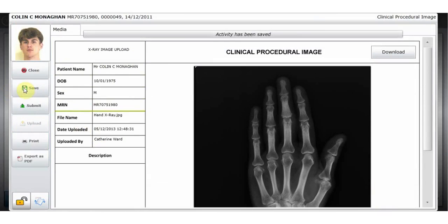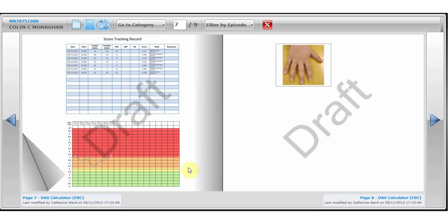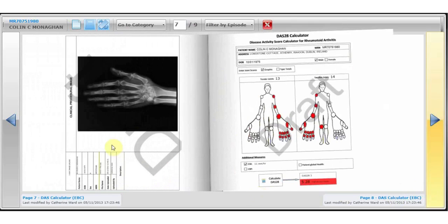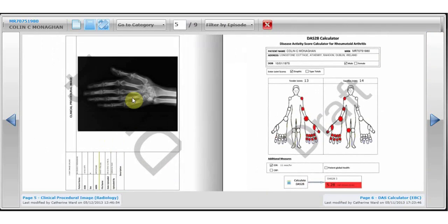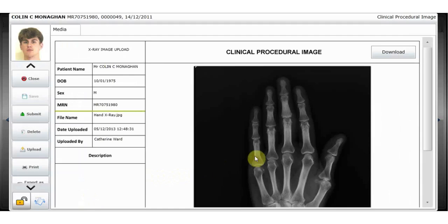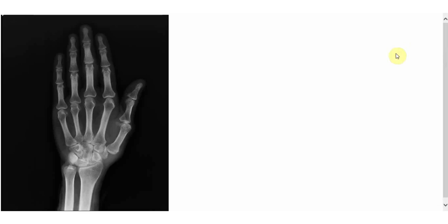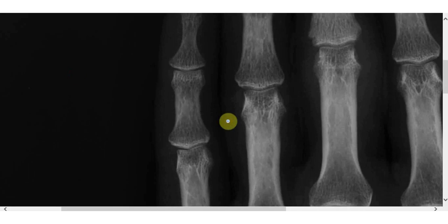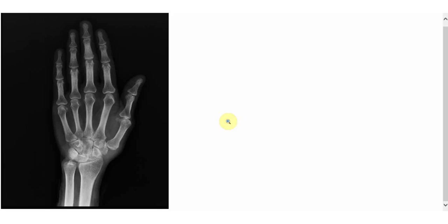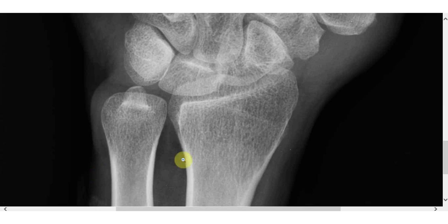Once the image has been uploaded to the server, the user can click download from any location in the hospital and download the image. A zoom function is available to allow the clinician to zoom on areas of the image.